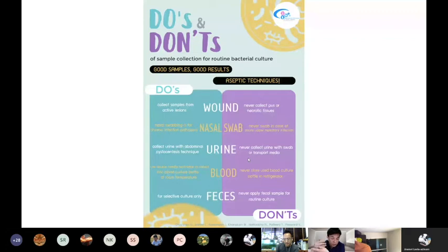Or maybe you can replace it with specific pathogens, or targeting only some bacteria, as one of the indications for cultures from the feces. And also some of the information on the urine part. You could give some additional information during presentations, like the storage times. I think that's so important that people need to know about the sample: if you collect after 24 hours, it would not work anymore.